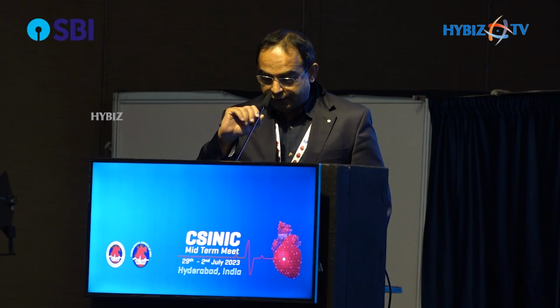Then we put a physiology wire. We did an RFR, and this was the RFR. It was in fact non-significant. The RFR was 0.96. The contrast FFR was also done. That was around 0.94. The cutoff limit is 0.83 for contrast FFR. And then we did a pullback OCT from LAD to LM, and also from LCX.